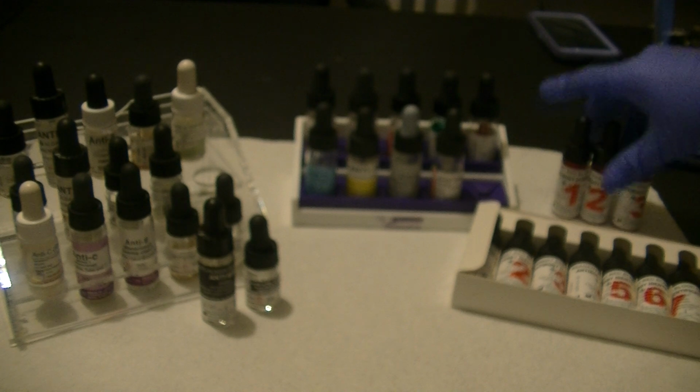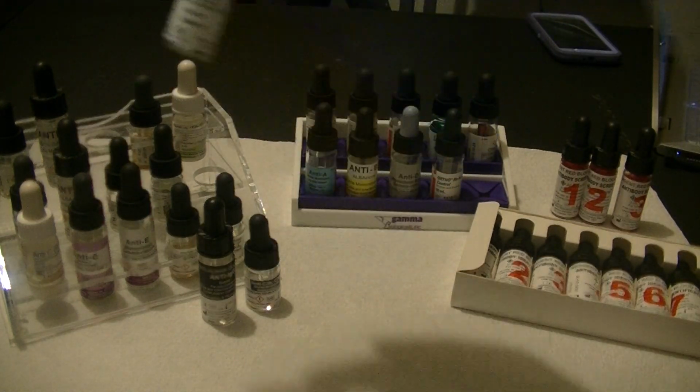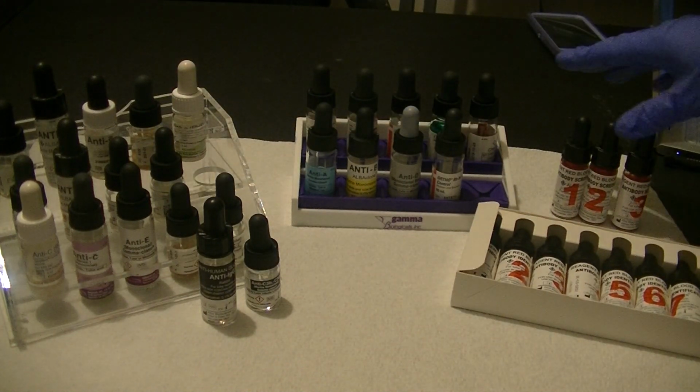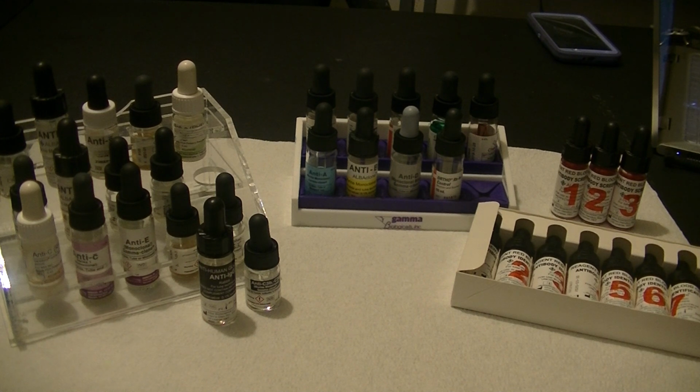If somebody has antibodies to an antigen like little s or M or Duffy B, then they can be detected by mixing that person's plasma with reagent red cells that have those antigens on the cells. We will learn more about this test later in the class, but we use reagent red cells to test a patient's plasma for antibodies we do not normally expect to be there.